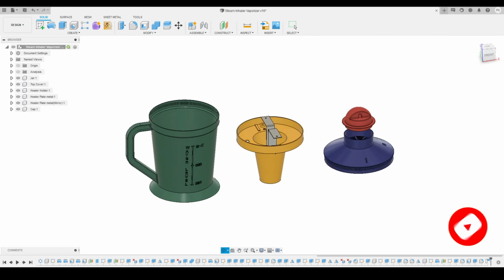You also have to make sure that you are not over defining your sketches, because that is not going to work. You only have to provide those dimensions which are necessary. Here you can see right now some entities in my sketch are still blue because I had not defined my sketch 100%. Whatever line is completely defined turns black. So our target is always to define every piece of the components.